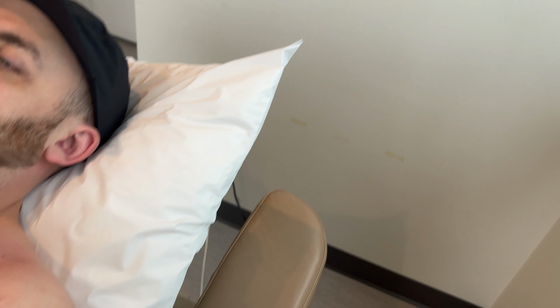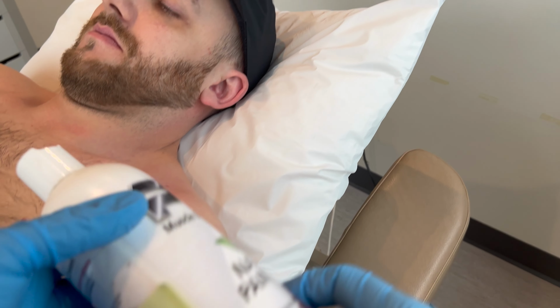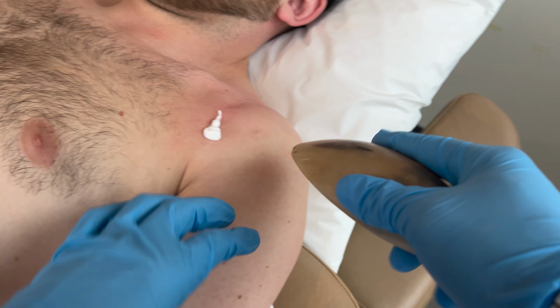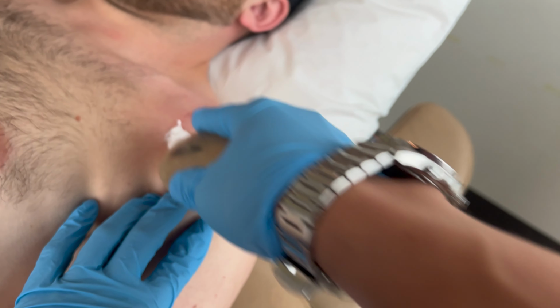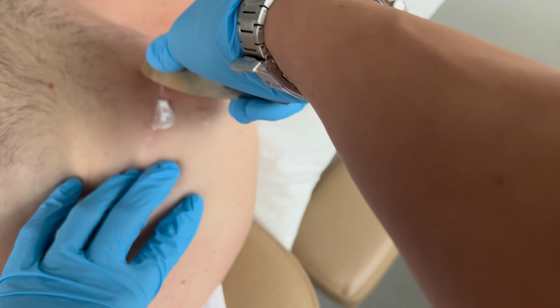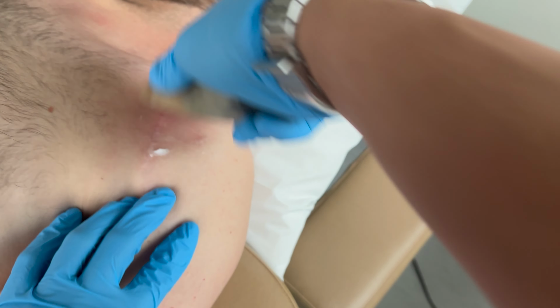For me, the common tool I like to use is Graston as a foundational therapy, which helps to increase blood flow to the region.